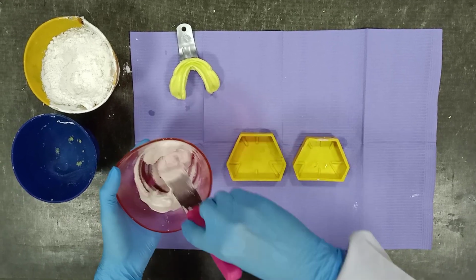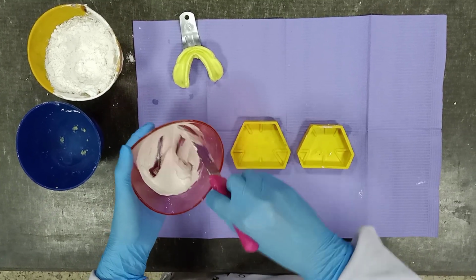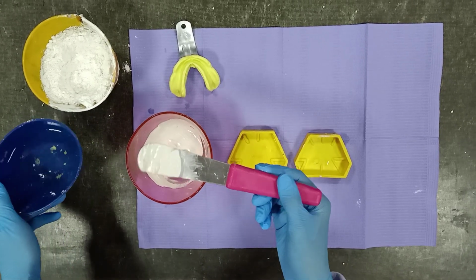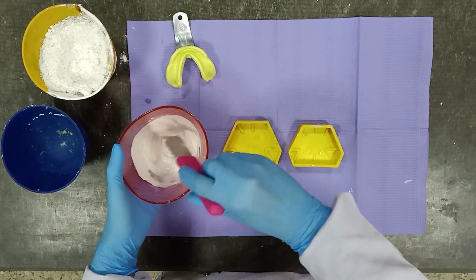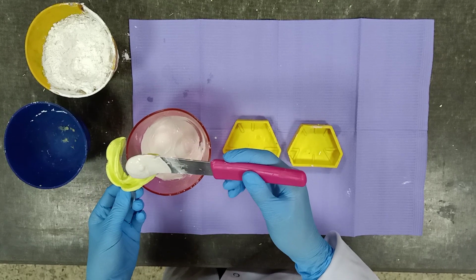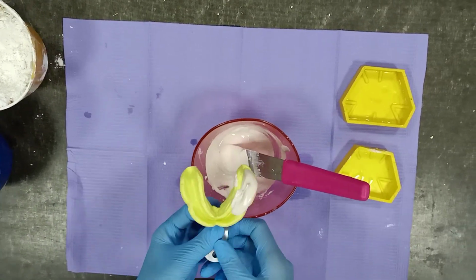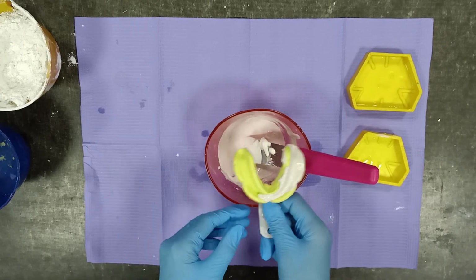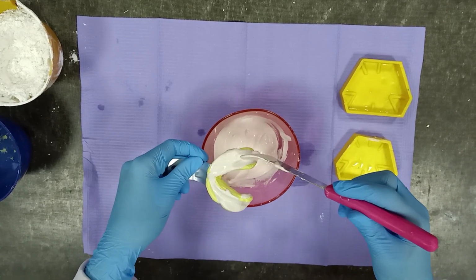We are going to pour the first layer of the plaster inside our impression, as you will see, to get all the details that we want. We are adding a little bit of water to make it more creamy. Then pouring our first layer, tapping the impression on the sides of the rubber bowl to get out all the air bubbles that we don't need, so all the details are recorded.